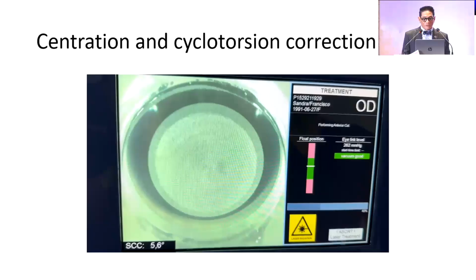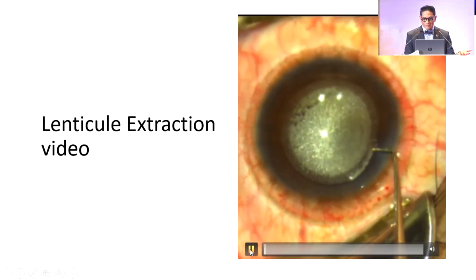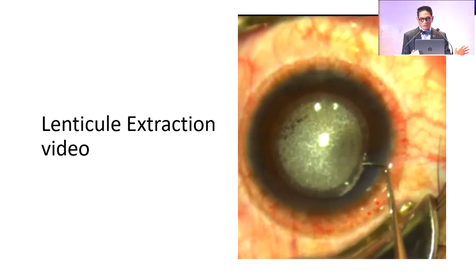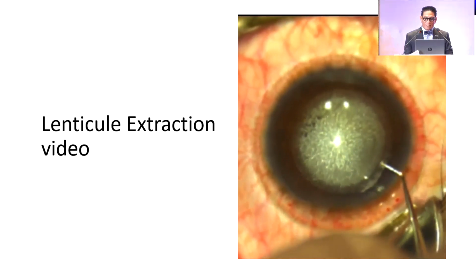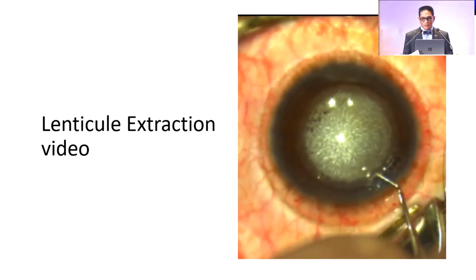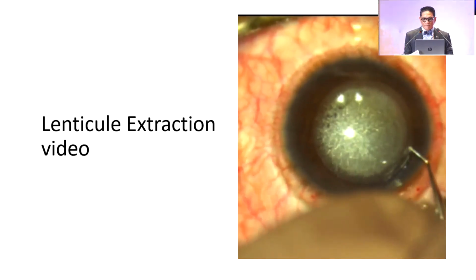So this is just a short video of how I do the lenticule. It's pretty slow because, as I told you, I've been doing this for only one year, but so far I'm happy. As you can see, this patient has some black spots on the upper left corner.